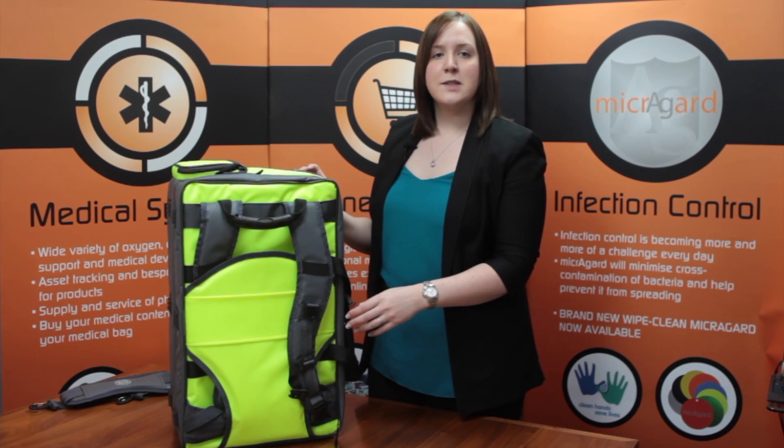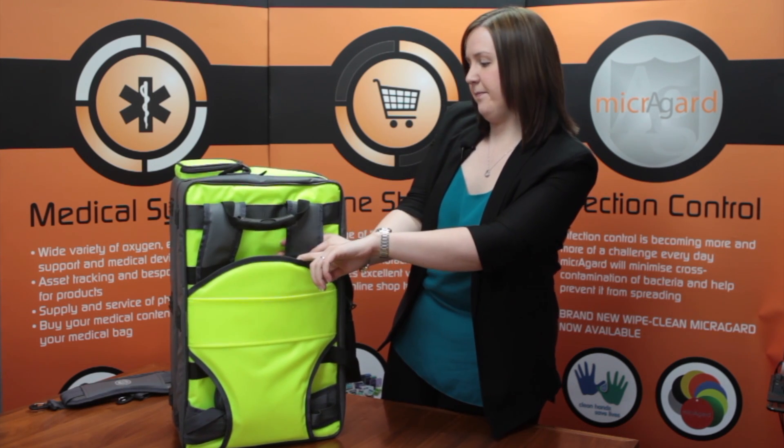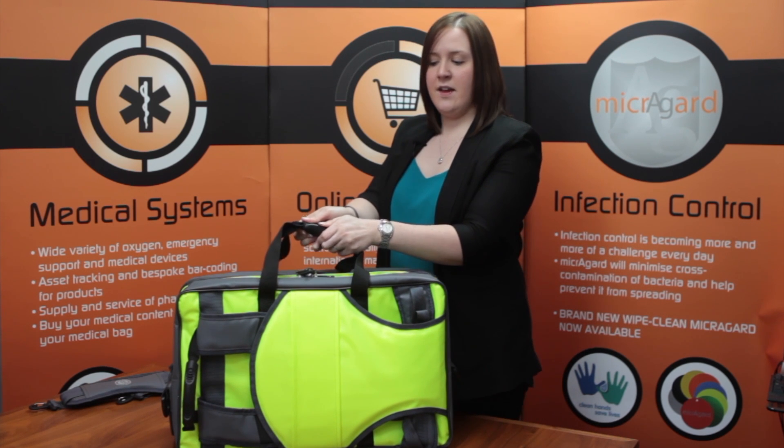There is padded lumbar support behind which the backpack straps can be easily hidden away, like so, along with a durable handle for quick pickup. It also has rubber twin lock handles which can be easily secured together in a rush.